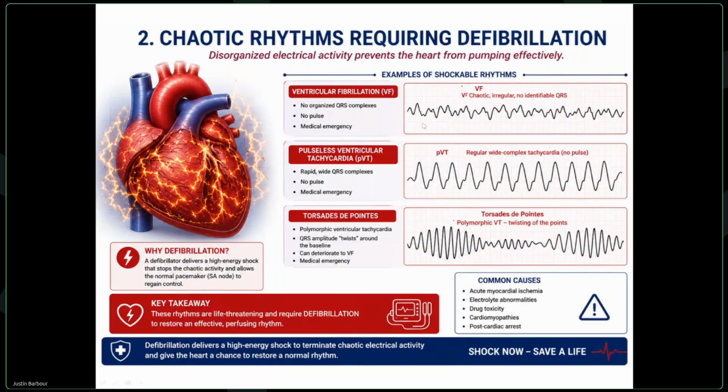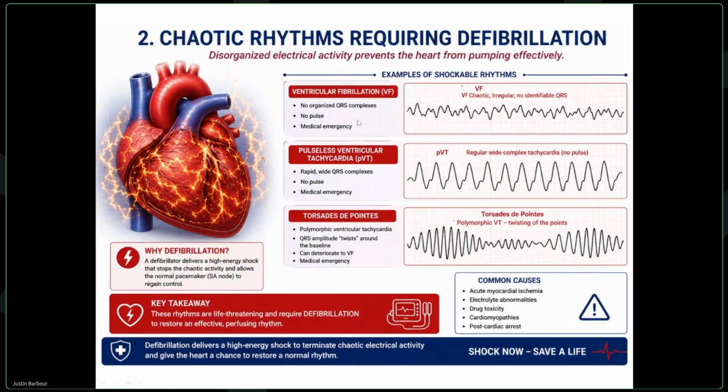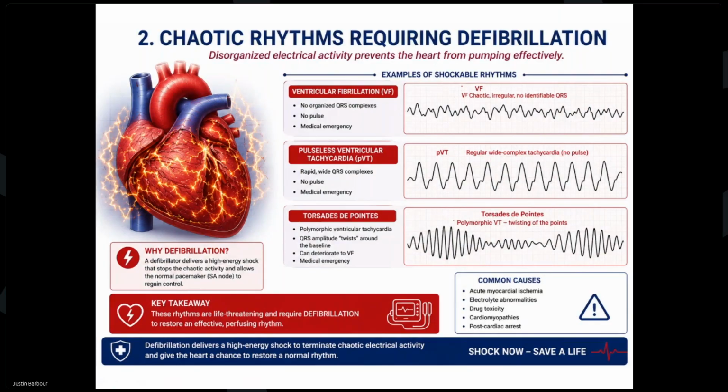So normally it's fibrillation, but there are some other heart conditions that you can reset also with defibrillation. Pacing and defibrillation are two different things. Defibrillation is when you're trying to reset the heart electrically. Pacing is when you are telling the heart when to pace, and through increasing or decreasing the amplitude, you're telling the heart how hard to squeeze.